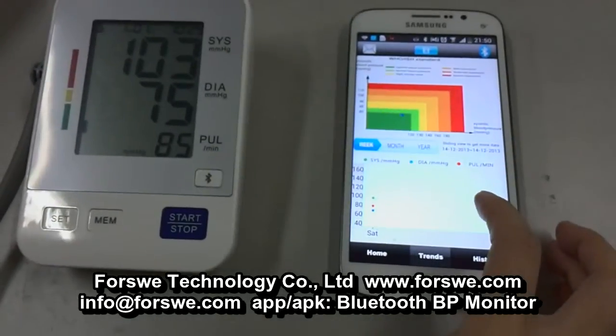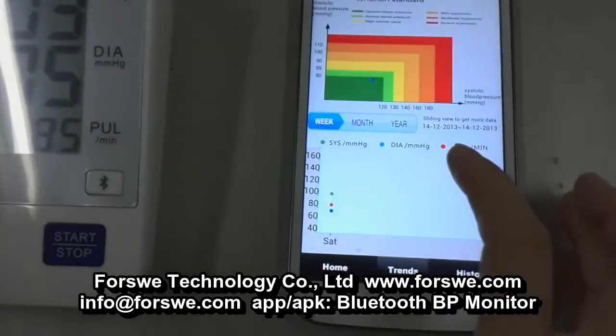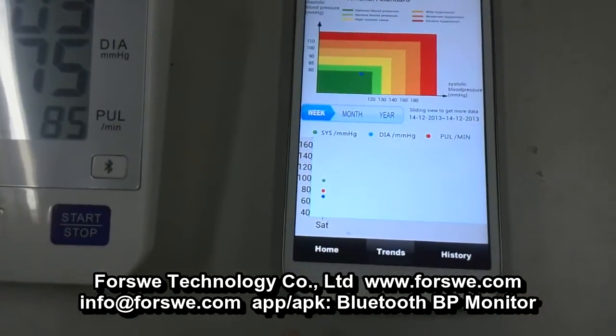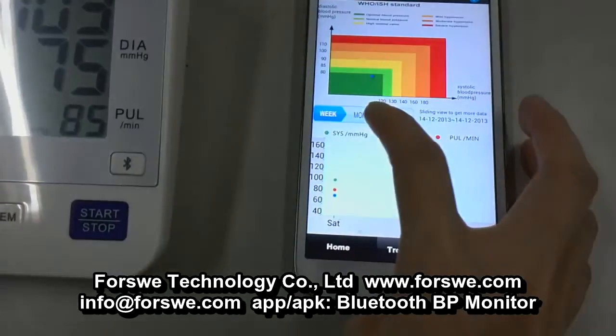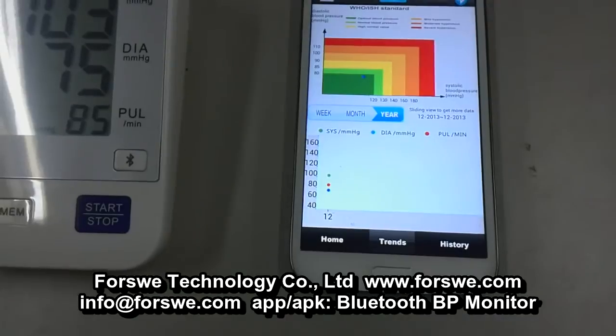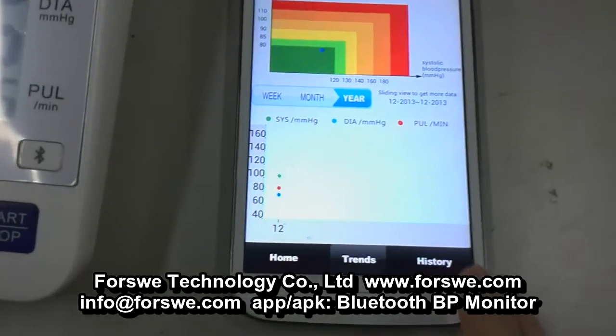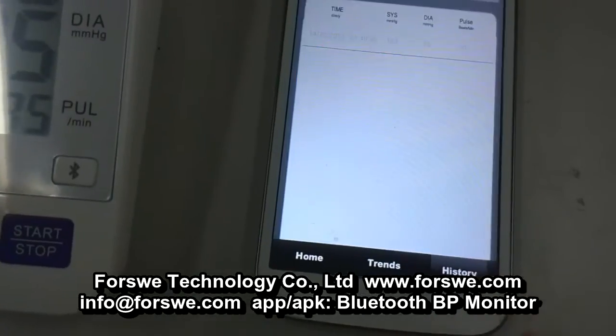From the trends page you will see the general data. You can view the general data by weekly, monthly, or yearly. All the records will be saved in the history page.